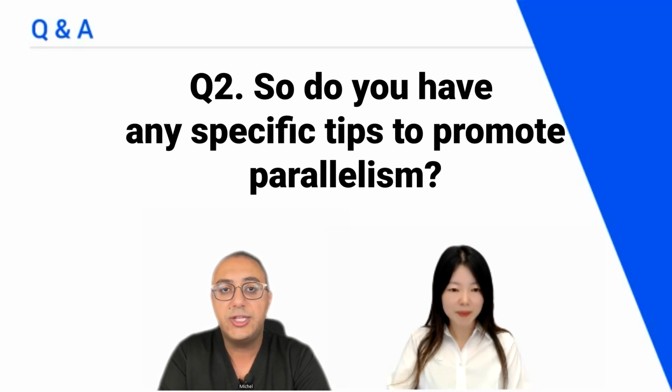So each implant company has multi-unit abutments with different angles, maybe 15 degrees, 30 or 45 degrees. So I always advise you to put the multi-unit abutments on the same day of the surgery. So you can adjust the angulations of all the implants together and correct the parallelism using the multi-unit abutments. This is the best way to get a good path of insertion between the final implants' screw channels from the restoration.